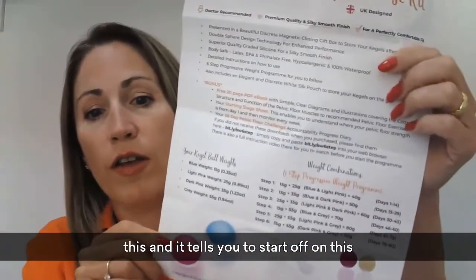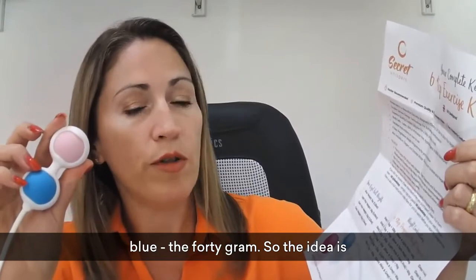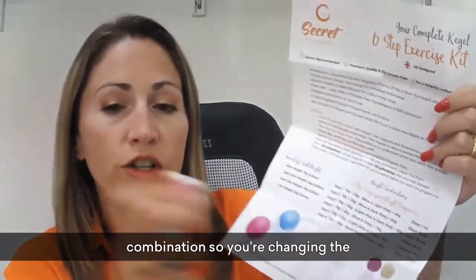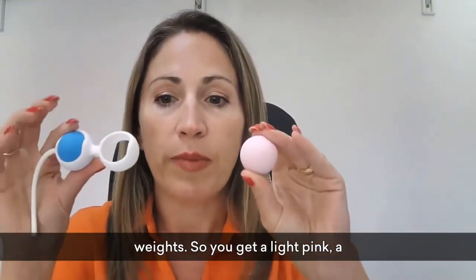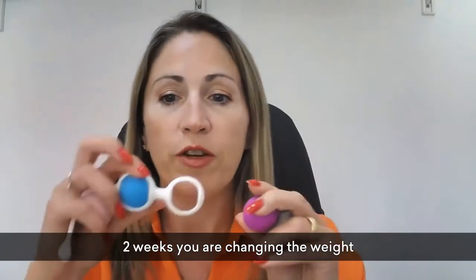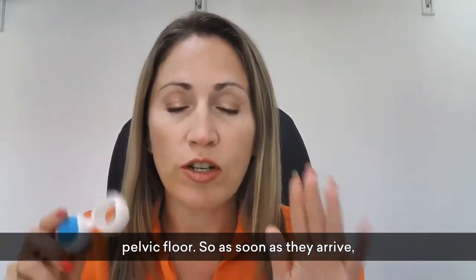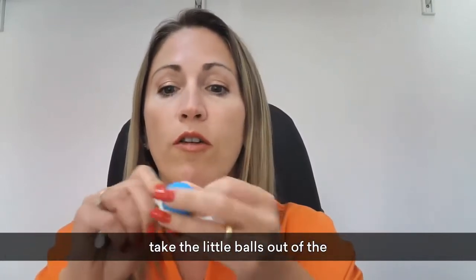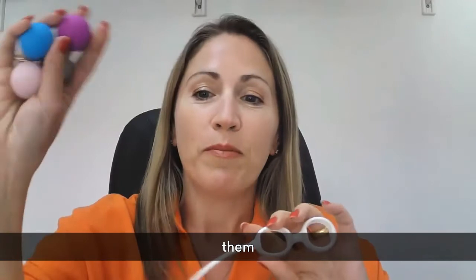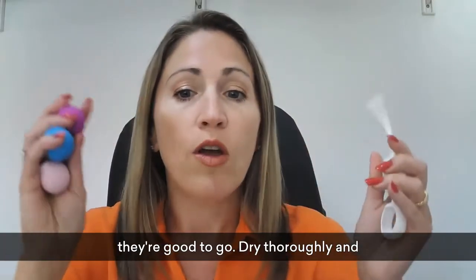The instructions tell you that you start off on the light pink and blue weight combination — the 40 gram. The idea is that every two weeks you move up in the weight combination, changing the weights. You get a light pink, a blue, a gray, and a dark pink, so every two weeks you're changing the weight combinations, gradually and safely challenging your pelvic floor. As soon as they arrive, take your little balls out of the holder and place all four balls and the holder into a pot of boiling hot water.